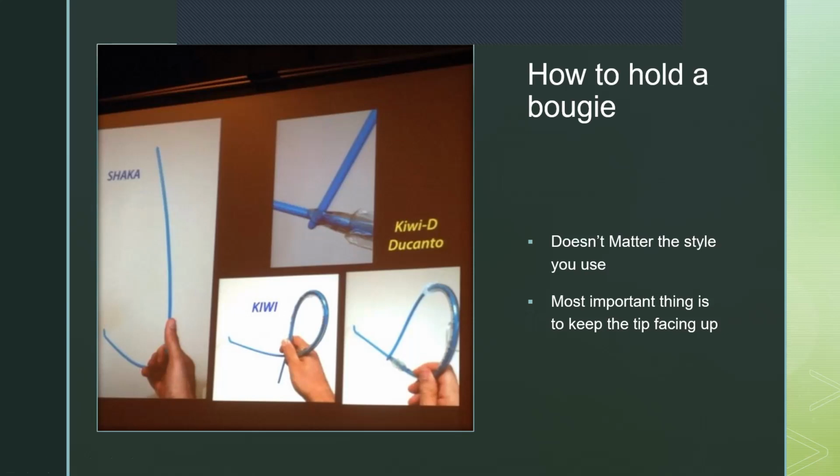All right, you all remember hang 10, you were small when hang 10 was popular, but it was out there, right? So basically what happens, the back end goes out that way, and the tip is controlled by your little finger. Whichever way, you hold it out straight, you hold it there. So basically what it's done is it's shortened the bougie so that you can actually maintain more control as you move it a little bit up, a little bit down.